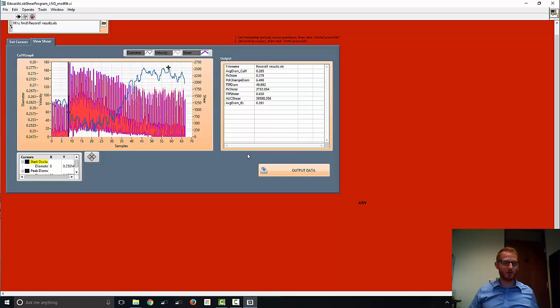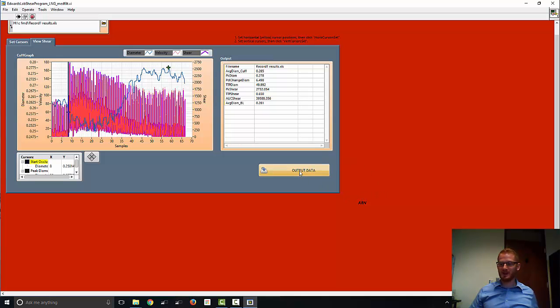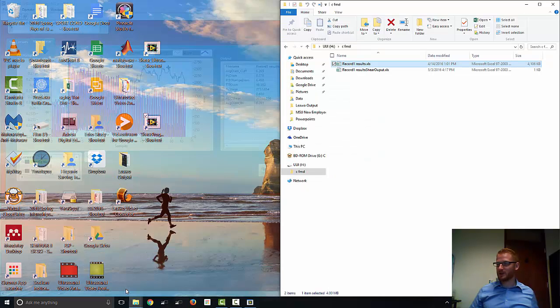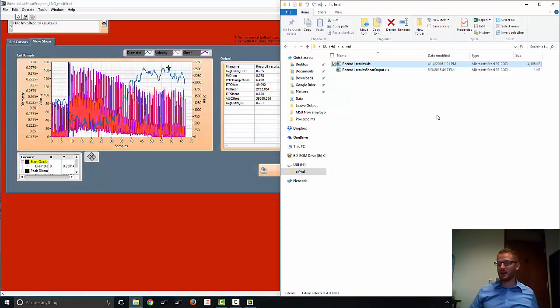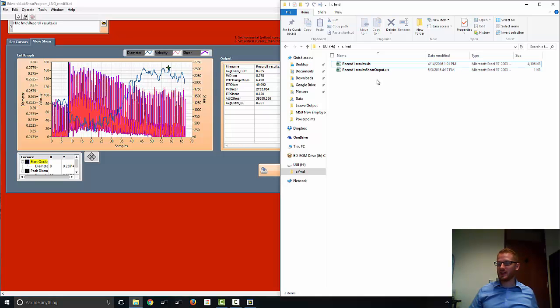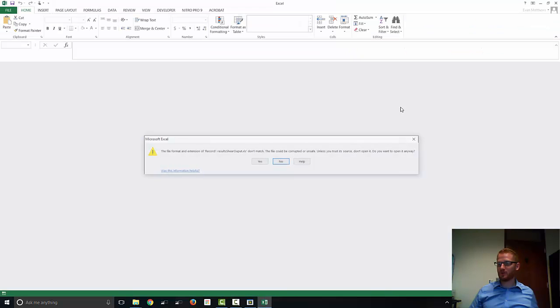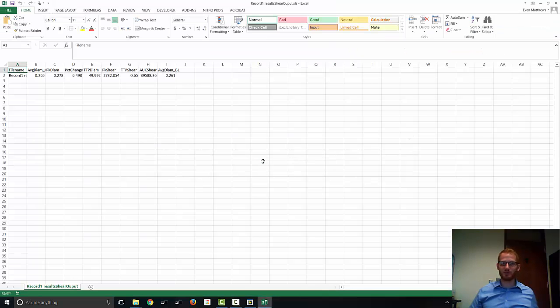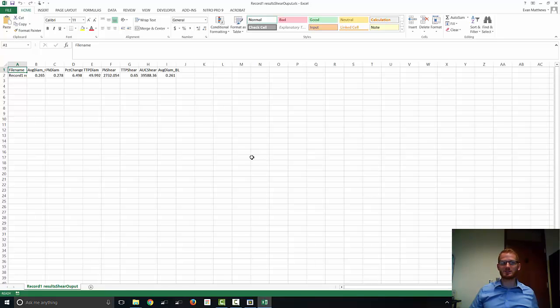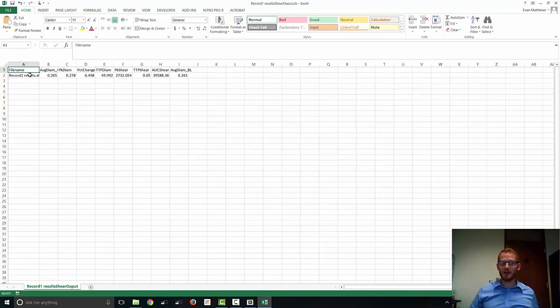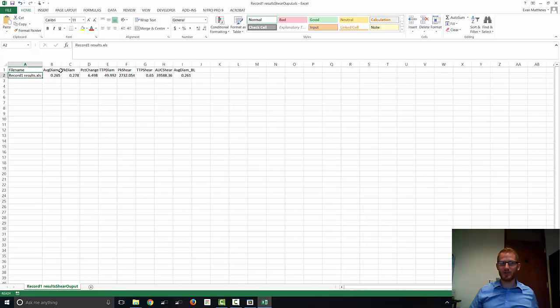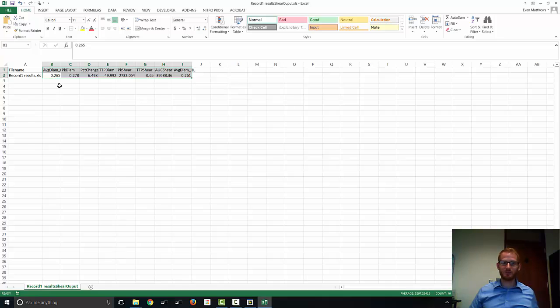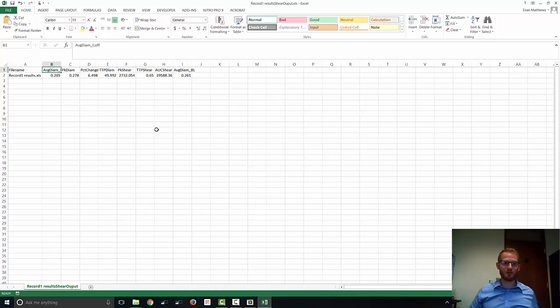If you want to do other calculations, you can do so using all these values. But all you want to do now is hit this output data. And it will save the data to the same location where you had the file you put into the software program. So this is the file we put in. And this is the output. And so again, if you open this, just hit yes. Again, it's looking for, it's telling you it's not a real Excel file. It's not a big deal. We know that. We have the file name that the data came from. And then all of those same values with their titles here all in one convenient row. So take this, put it wherever you're storing your participant data, and that's it. So that's how to analyze a flow-mediated dilation test.